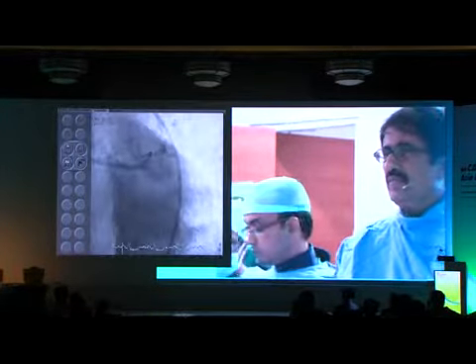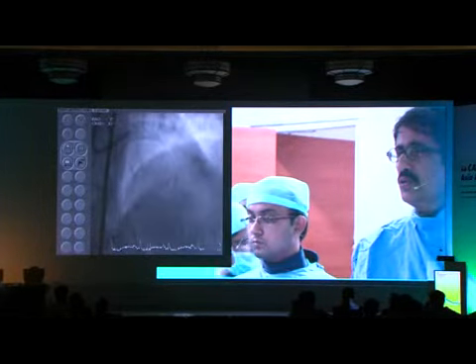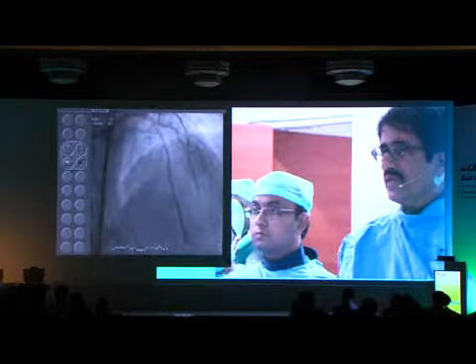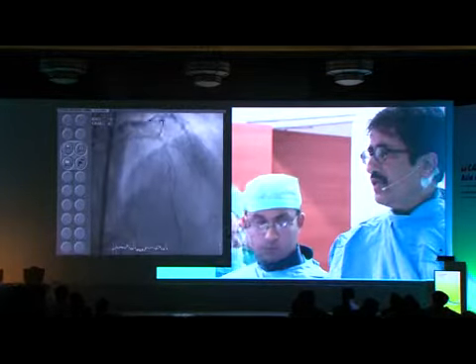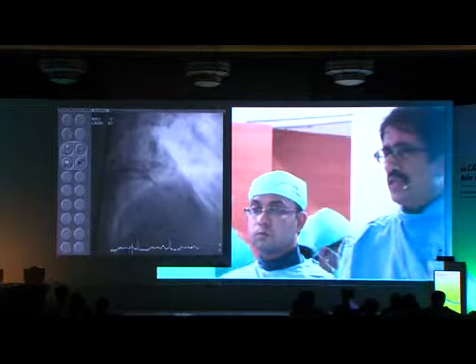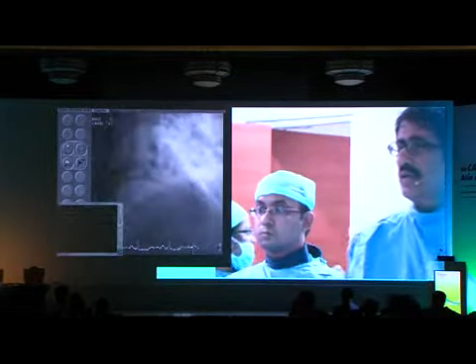We have two wires. This is a Cougar XT from Medtronic. This is a non-polymer wire. It's pretty good for long usage because of no polymer.